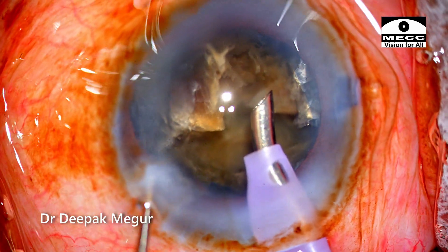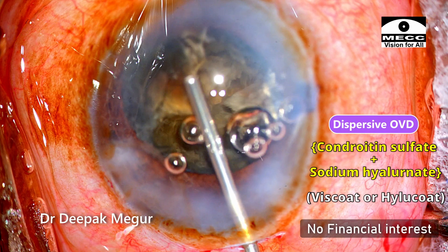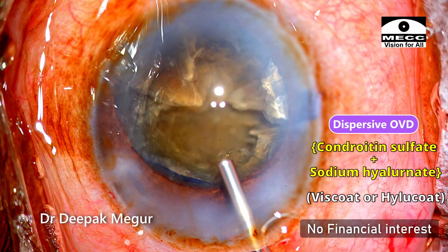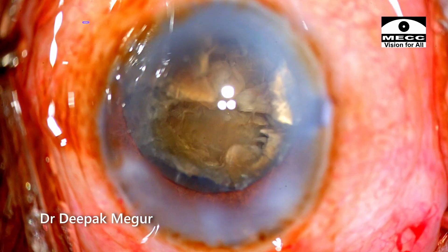Please note the amount of viscoelastic I am using and the number of times I am using it. After every fragment I come out and use viscoelastic: dispersive OVD goes in first, followed by HPMC. This is a sort of modified soft-shell technique.